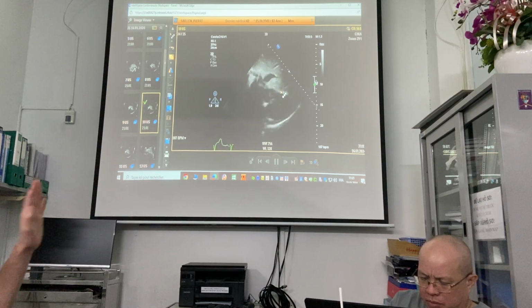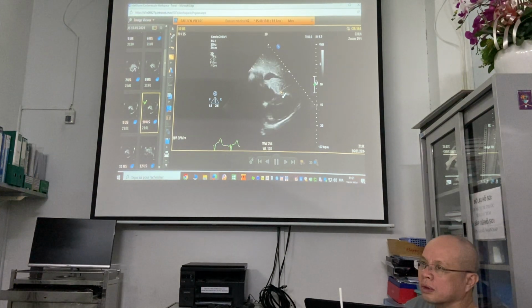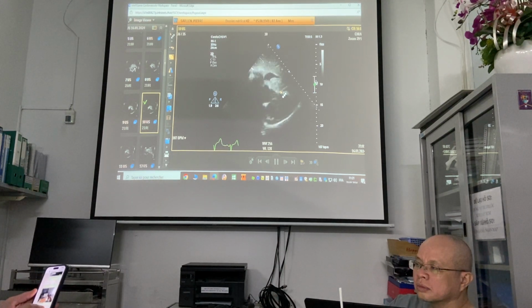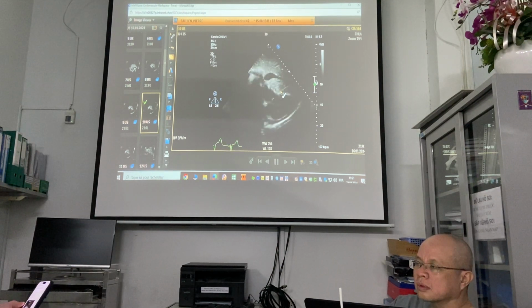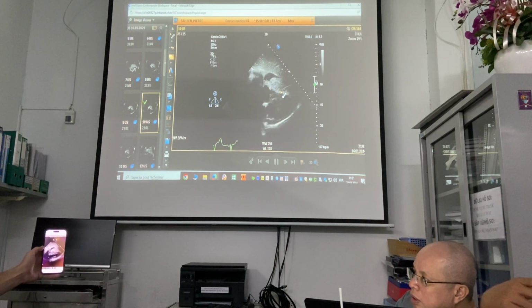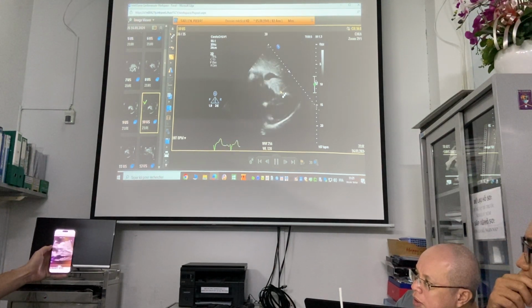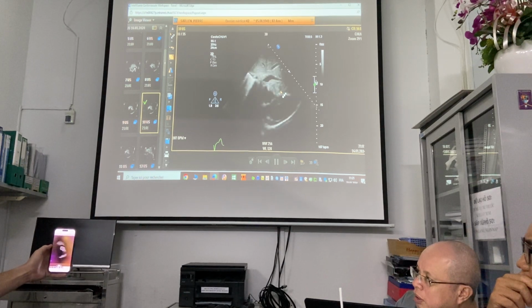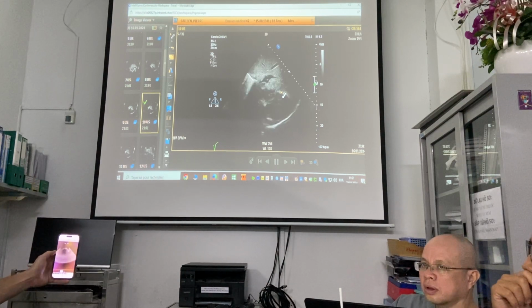So this is echo, it's not cath lab, huh? Yes, good. So I show you on WhatsApp. Ioannis, the doctor, called me last week. This was in the middle of the night, he called me and he sent this to me. So this here, see? For me, I say this is an intramural hematoma of the right ventricle free wall.